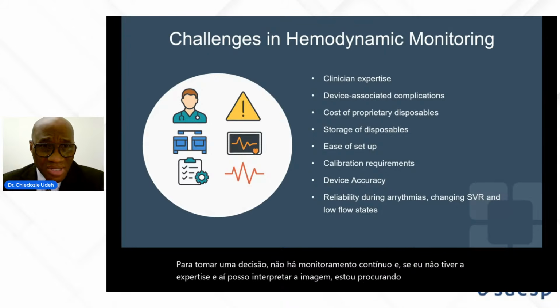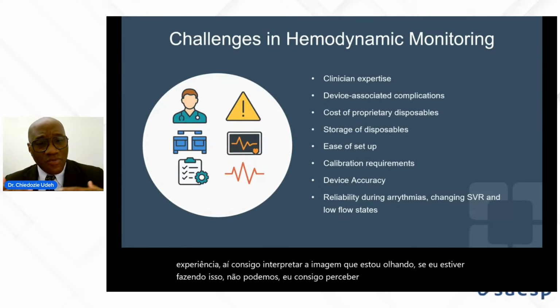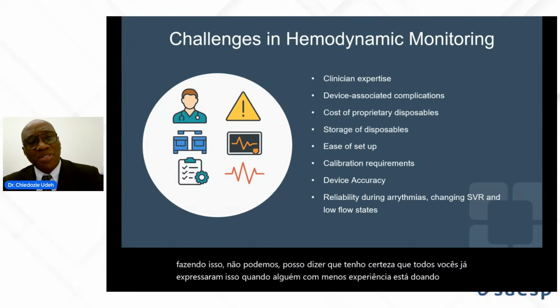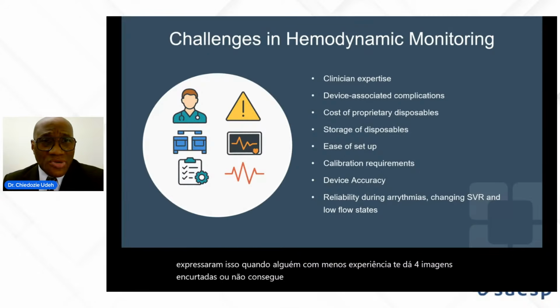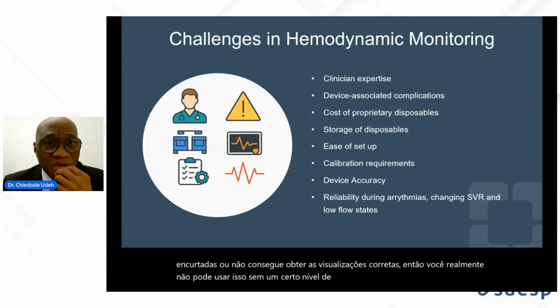If I'm doing a transthoracic echocardiogram, I'm sure you've all experienced it when you have someone with less experience giving you foreshortened images or not being able to obtain the correct views. And so you can't really utilize that without a certain level of expertise. And then, of course, the cost of complications.